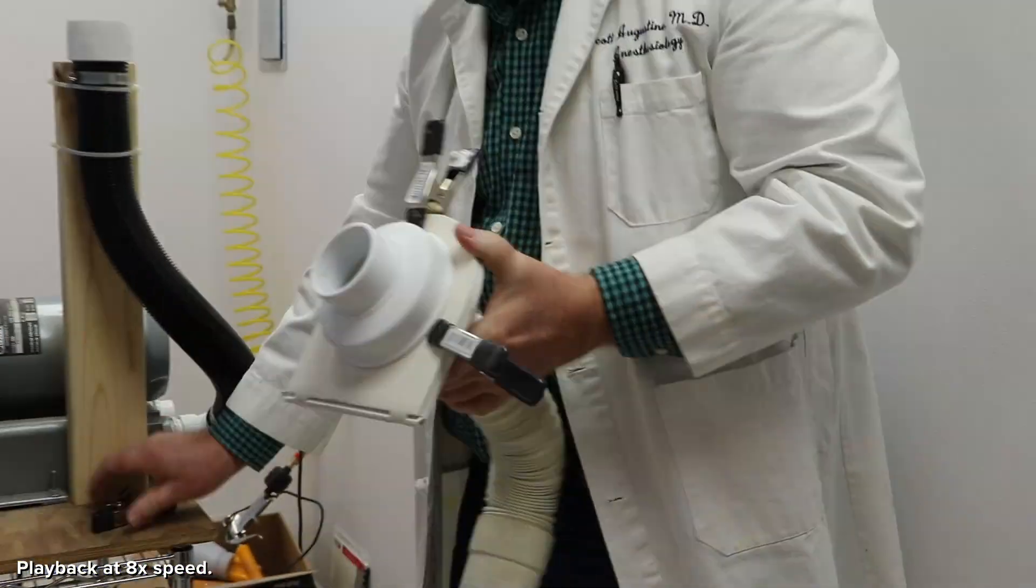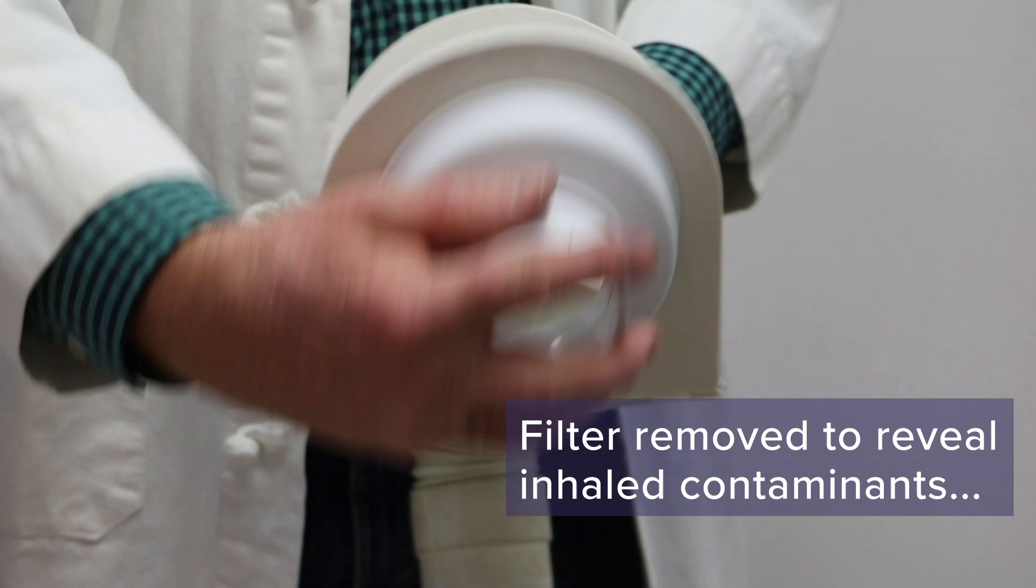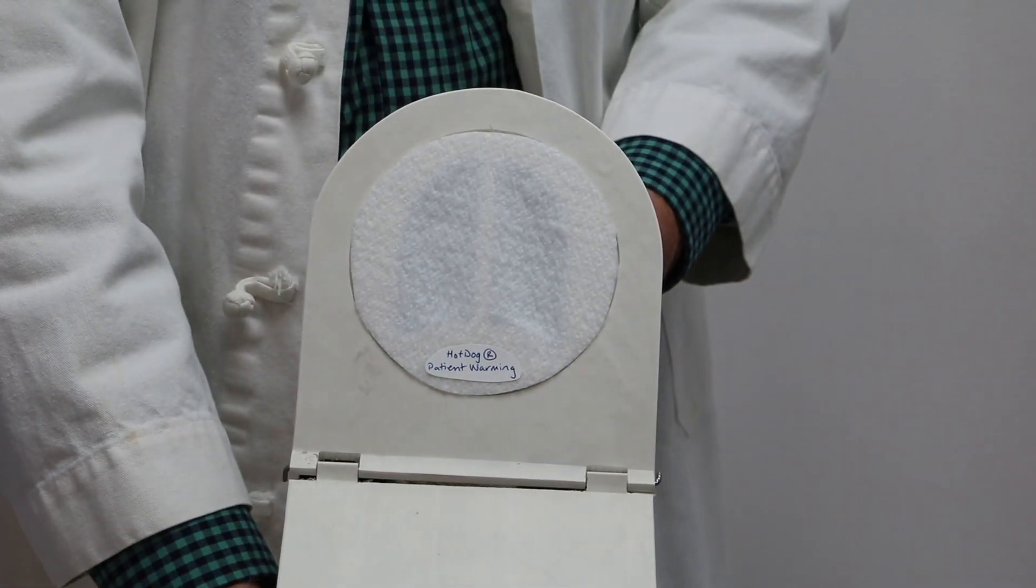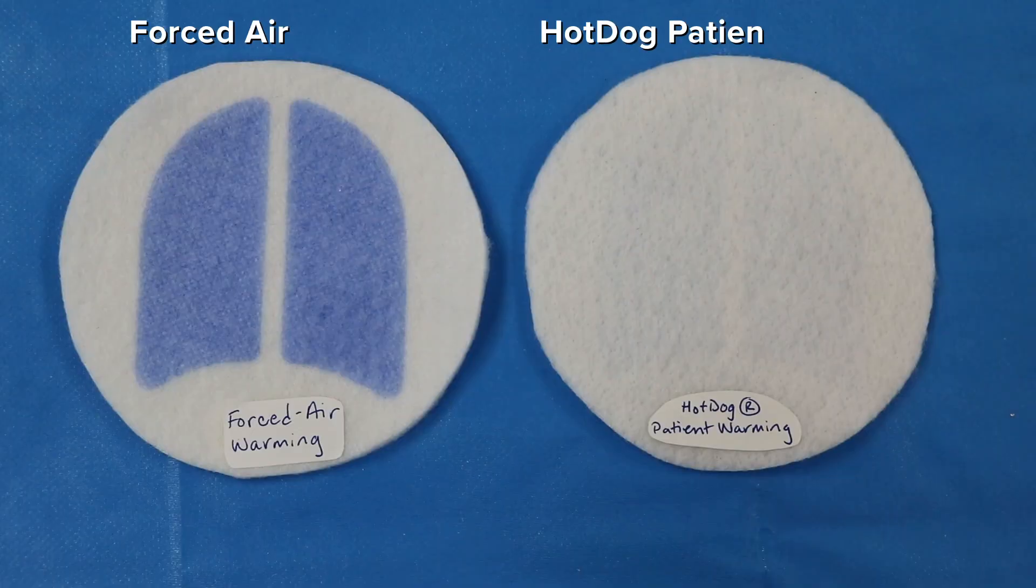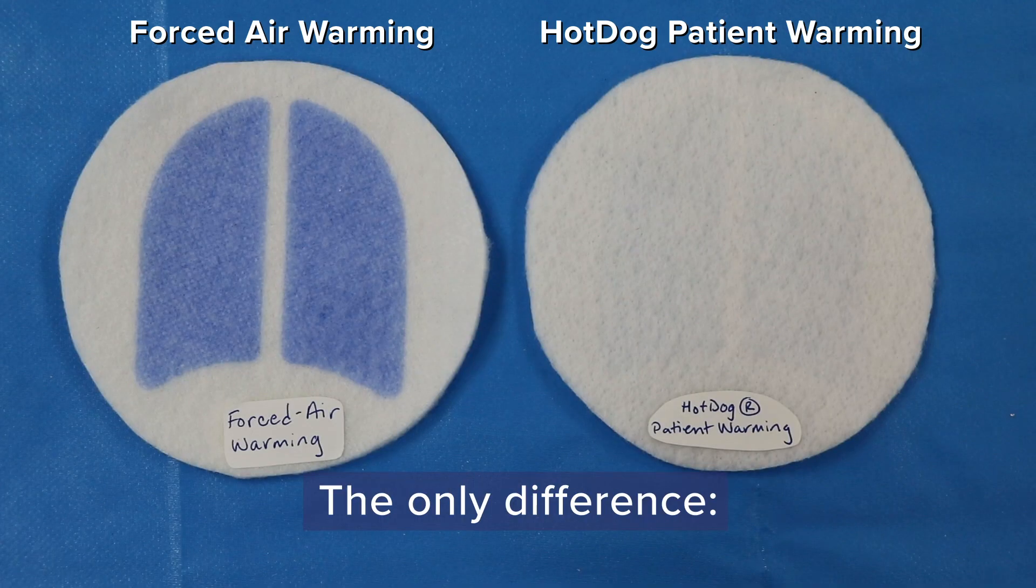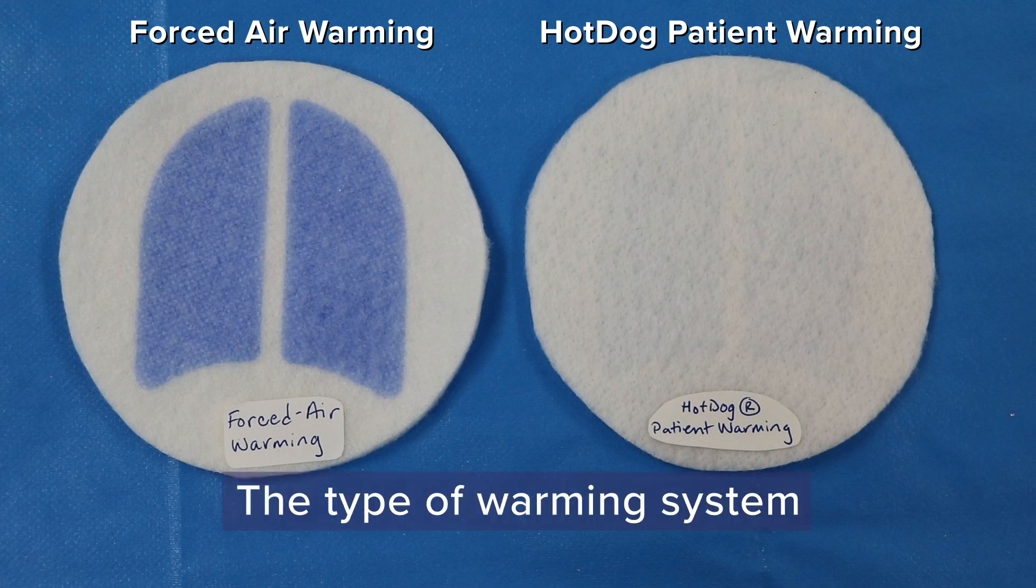The filter is removed to reveal inhaled contaminants. With the hot dog system on, the lungs remain virtually clear. What caused the drastic difference in the amount of inhaled particles? The conditions in each group were identical except for the type of warming system used.